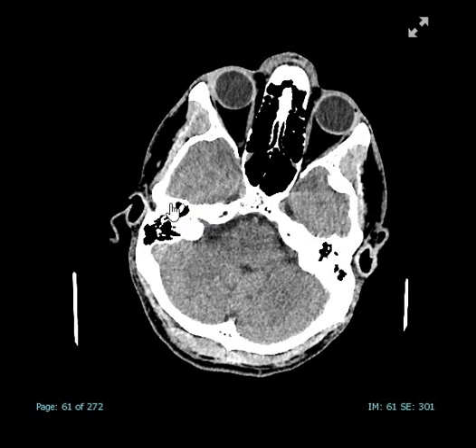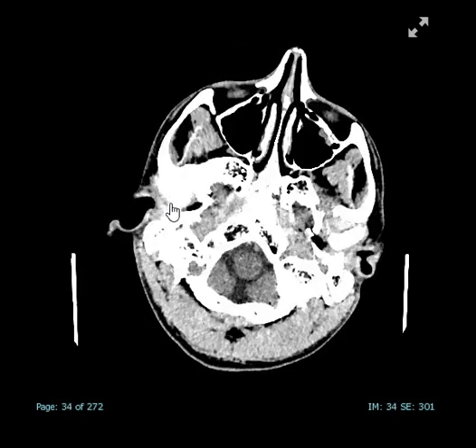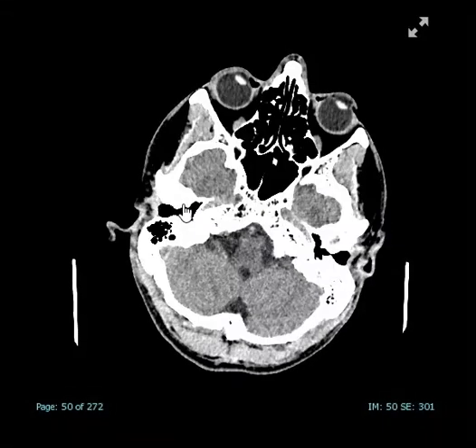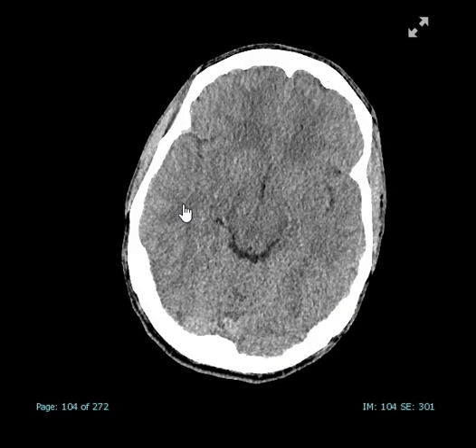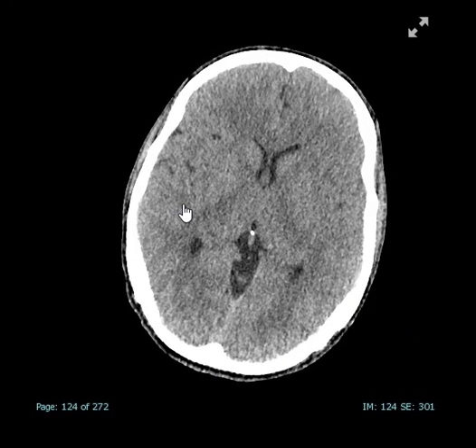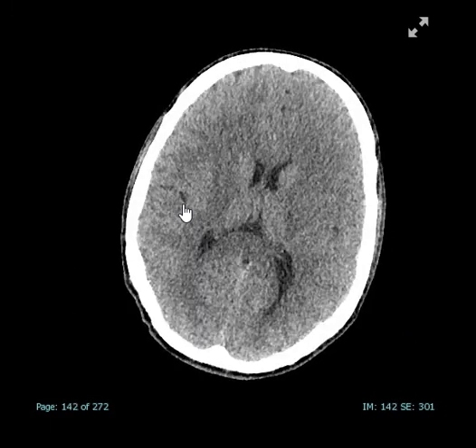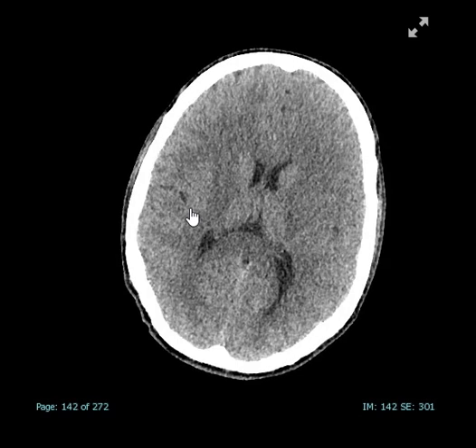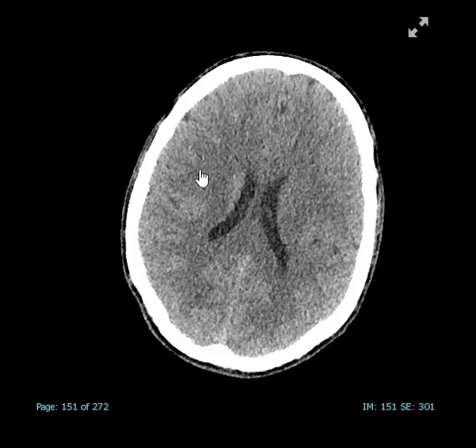Everything else on the scan looks relatively normal. This is a 20-year-old patient. As we scroll through, there's not much else going on really. But still, whenever you compare the left side to the right side, you can see the sulcation on the right side.